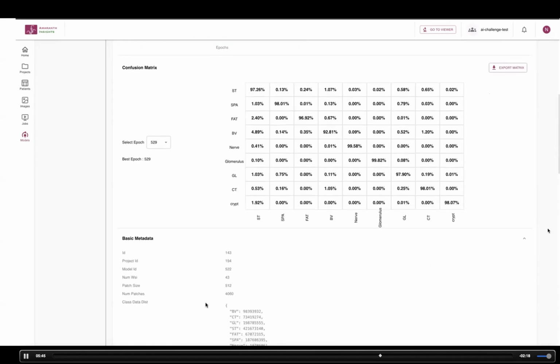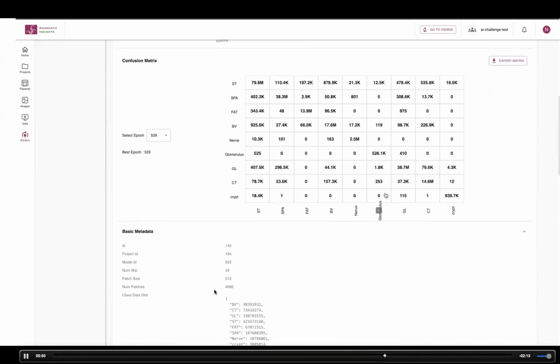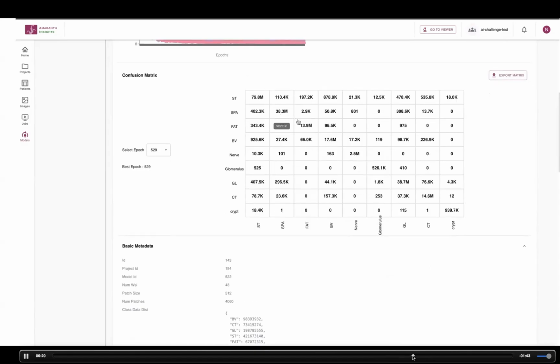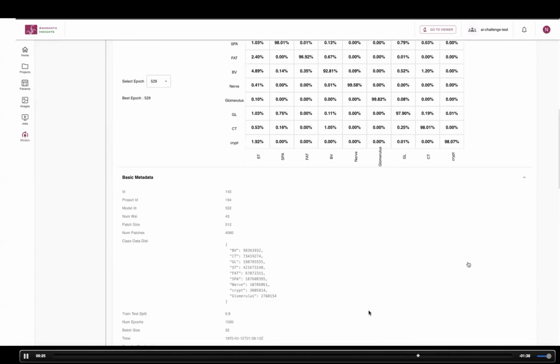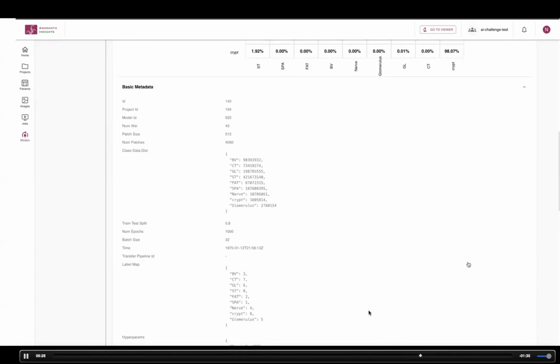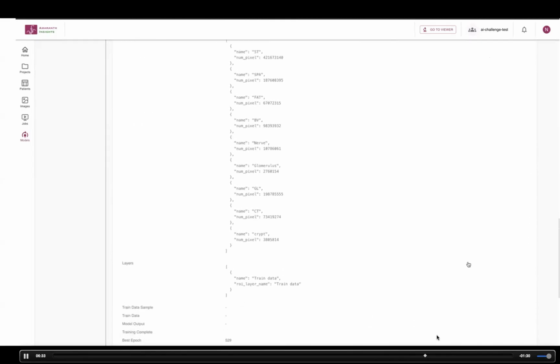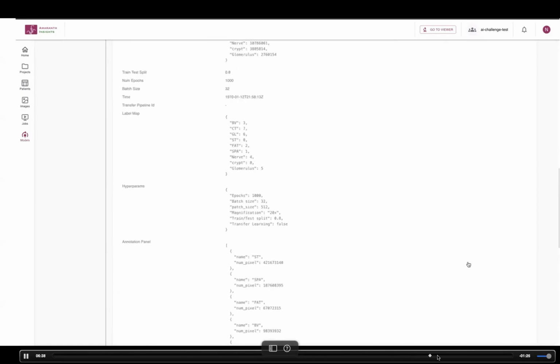And then this gives other details of the model, that there were 43 images that were used for creating this model, number of pixels for each annotation type. You can just look at the confusion matrix in pure absolute numbers or percentages. Again, more details on this in another session.